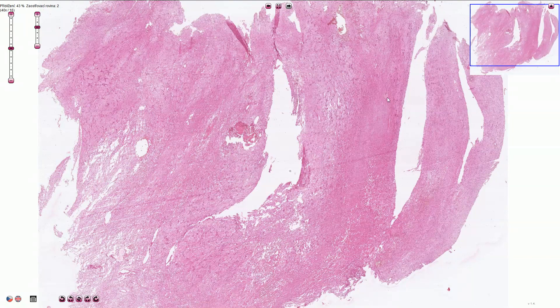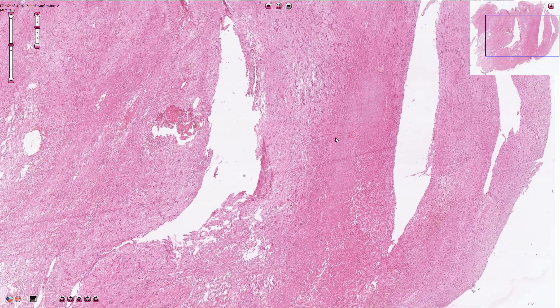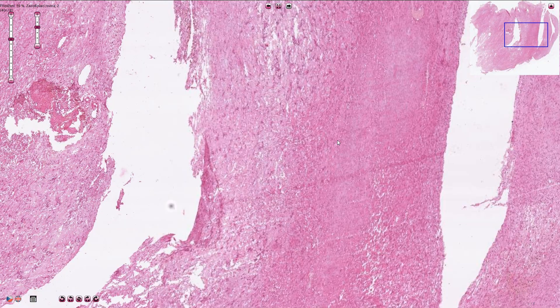On low magnification we can see that the tumor is composed of areas with high cellularity and of hypocellular areas. Let's go closer to take a look at both of them.